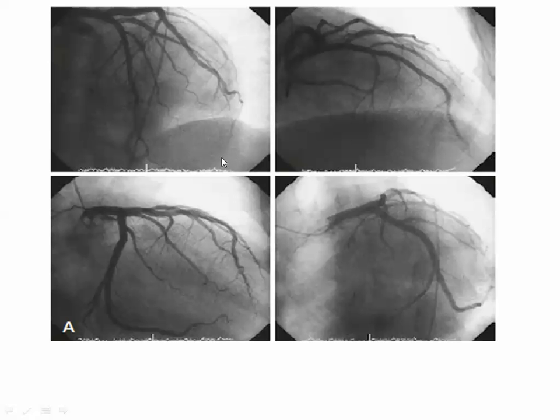What's this view? LAO. Where is the shaft? This is the shaft. This is AP, okay? Crossing the proximal LAD, so this is mostly AP. So AP resembling the RAO. So this is anterior, apex, inferior. This is the AV groove, and here is the atrium. Okay, so this is what? LAD, this is diagonal, anterior, okay?